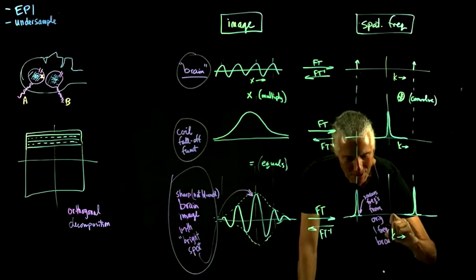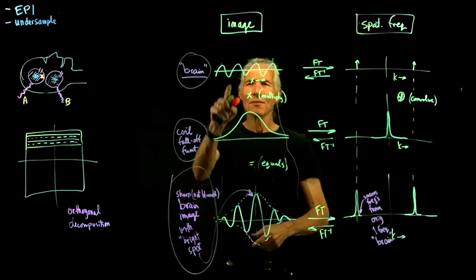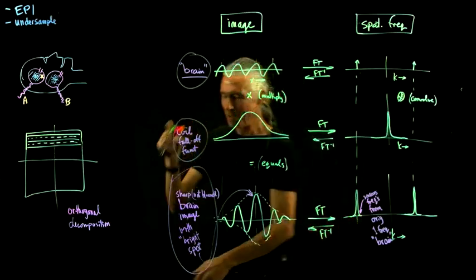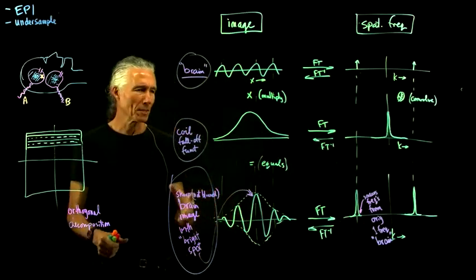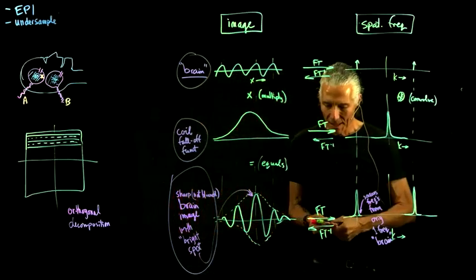So we had our stupid brain that only has one spatial frequency in it over here, and we kind of smeared it out into the adjoining frequencies, adjoining spatial frequencies. Now that doesn't seem to help too much, but the important point is this.